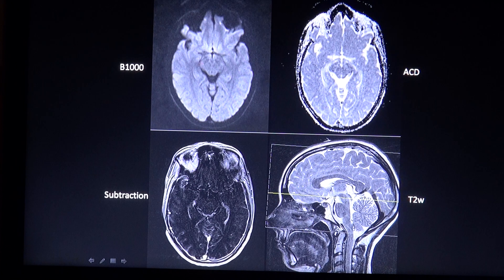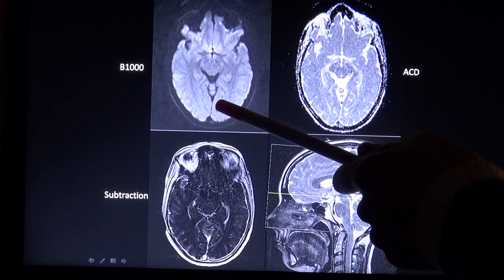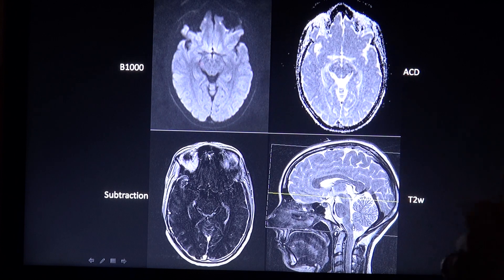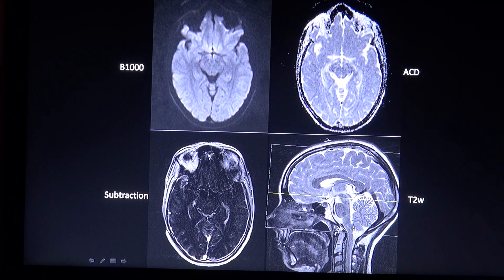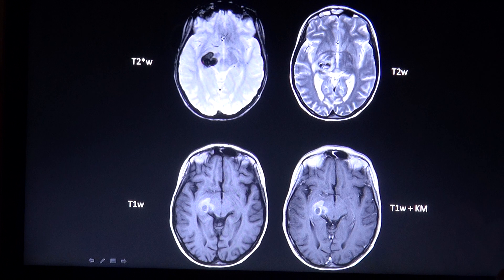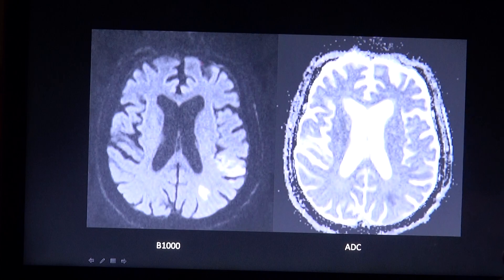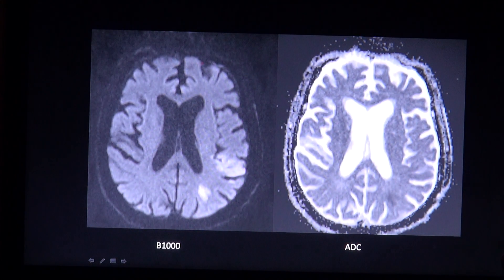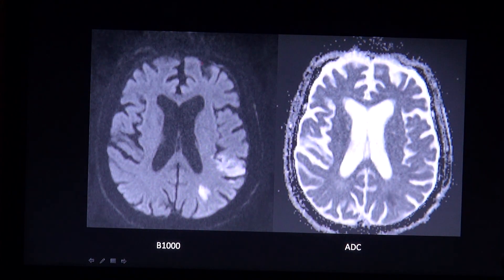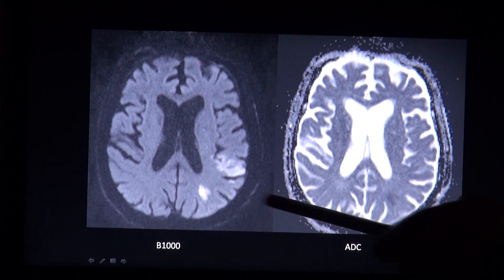Areas with restricted pathologic diffusion are bright on the B1000 image and dark on the ADC map, which is seen in cytotoxic edema. This is why the sequence is most important to look at in the clinical scenario of suspecting a stroke, where the ischemic brain tissue appears bright compared to the healthy brain, as seen here.